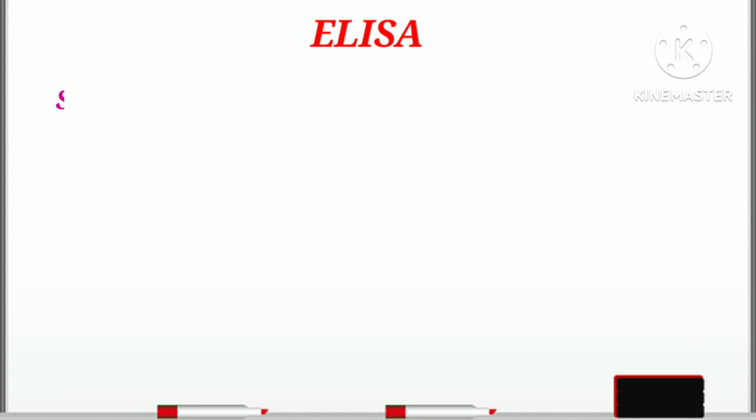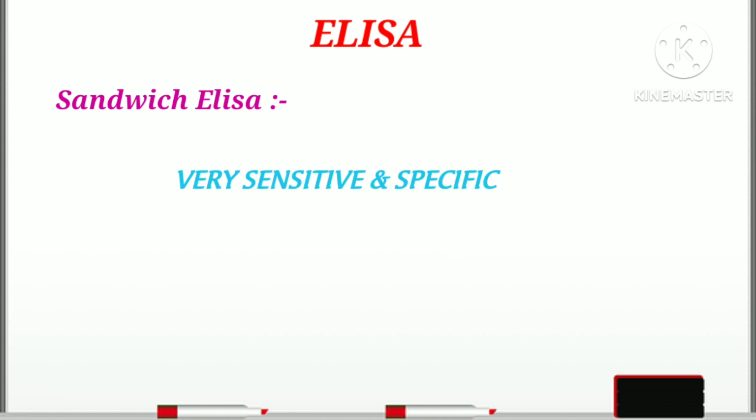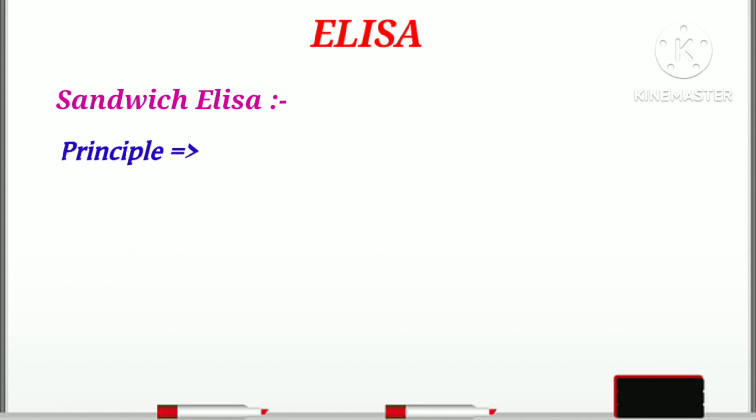Coming to the next point, sandwich ELISA. This is the most common and most widely used ELISA in immunology. This is a very sensitive and very specific ELISA, sandwich ELISA. What is the principle of sandwich ELISA?